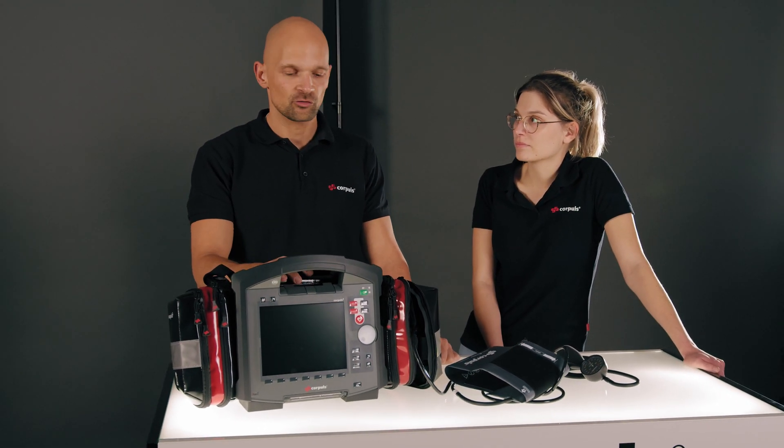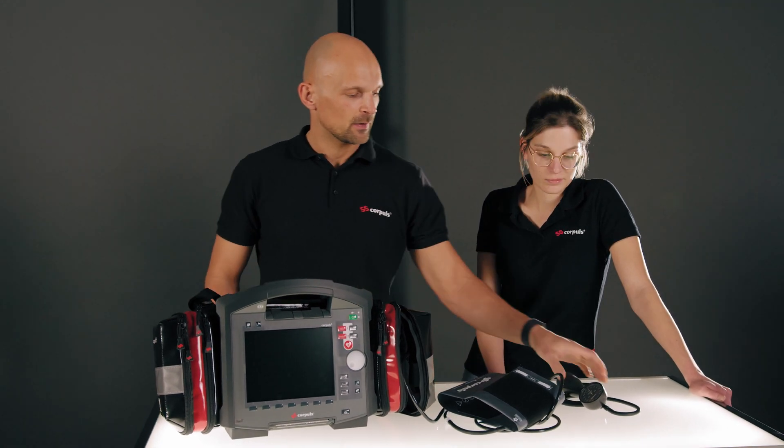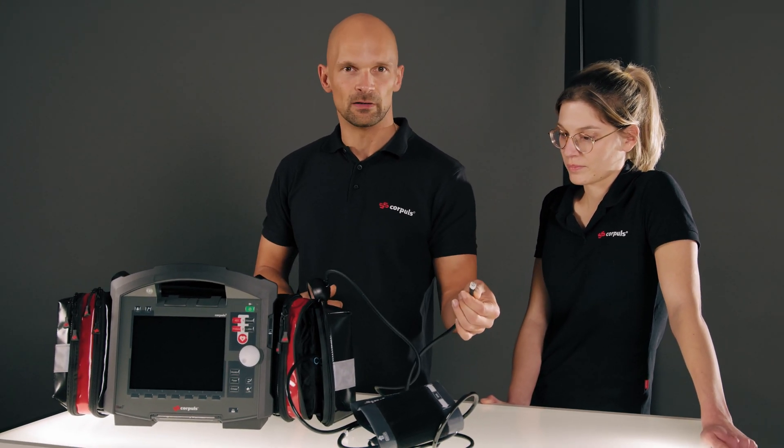Because an oscillometric — that is, automatic — measurement depends on influencing factors, we recommend doing the first measurement manually. For this we have a manometer, which can be easily connected to all common Corpulse 3T cuffs.